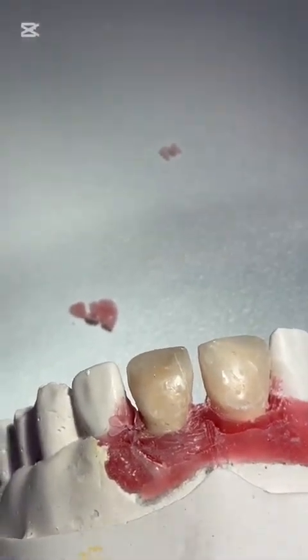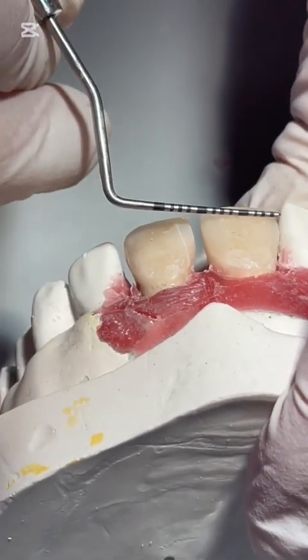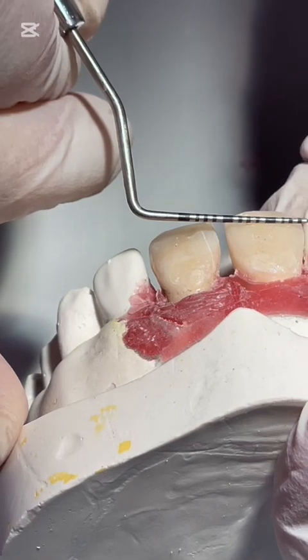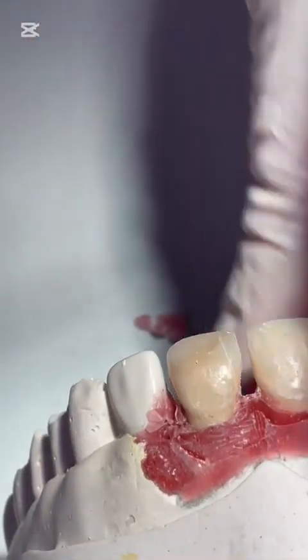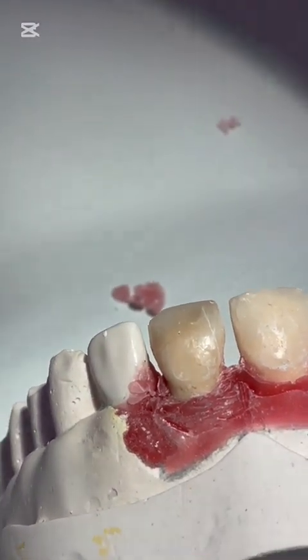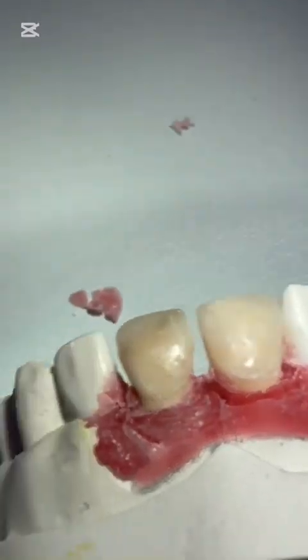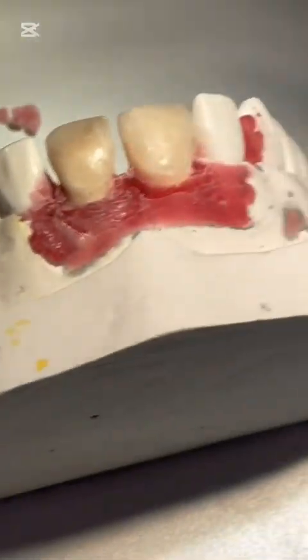Okay, now, so I took like 0.5 millimeter from the right central incisor. Now it's 10.5. Then my middle line will be exactly here, okay? So I will roughly add composites.